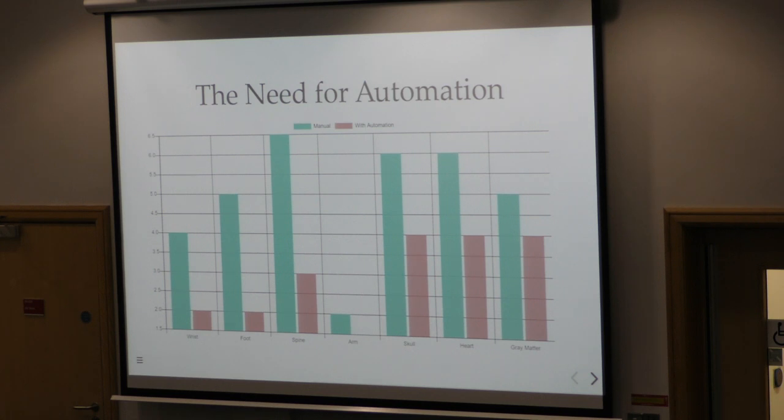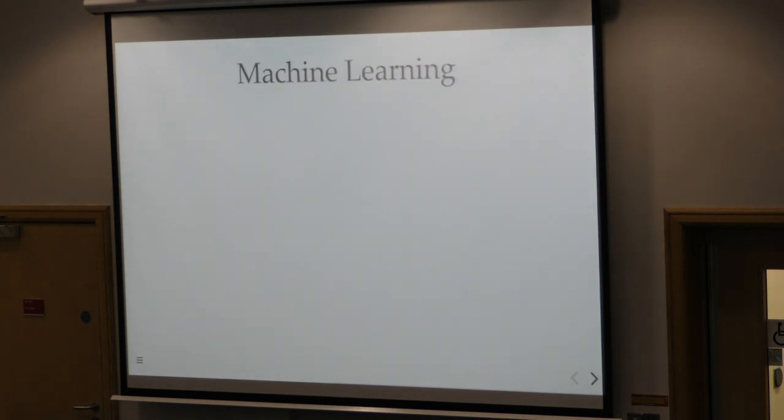In the 3 to the left of it, when you're looking at different bones, it's going to be very difficult to interpret where certain bones stop and where other ones begin. So one important part of our process is to be able to identify individual and independent bones and segment them as separate objects. And as Luke was saying, that can also be quite a subjective thing to do. So as everybody is wont to do now, they introduce a machine learning solution to speed something up.